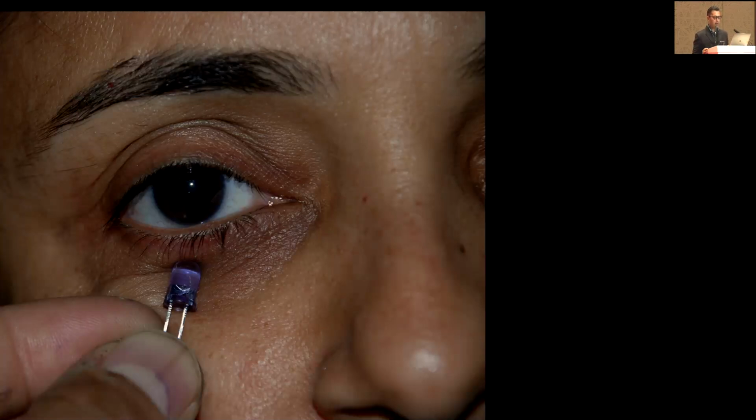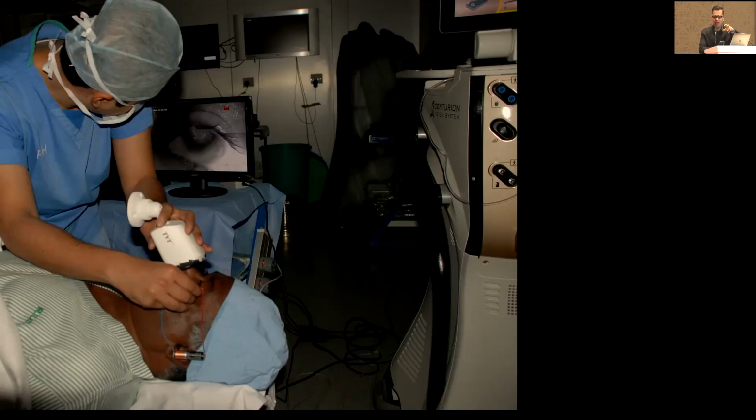So here we can see that we are using an infrared LED, much like the LED in the remote controller of your television, and doing a transpalpebral trans-illumination. So you're putting the infrared light underneath the lower lid and lighting up the eye. And on the other hand, here I'm using a security CCTV camera with a +10 lens. And I've removed the infrared filter, so the lens can pick up infrared light. And the moment you do that, you see this area of the junction of pars plana and pars plicata, which is where you want to fix the lens.